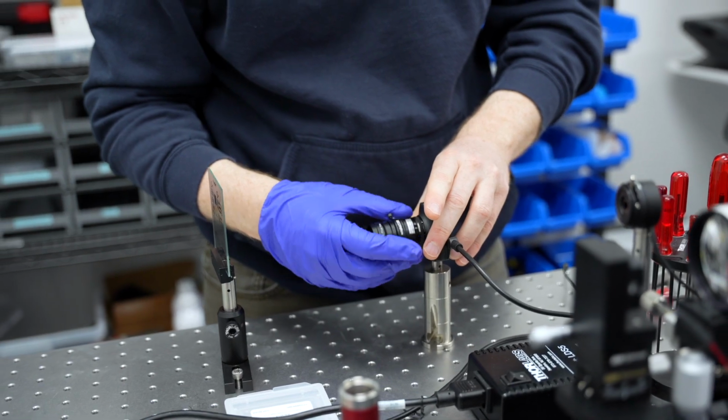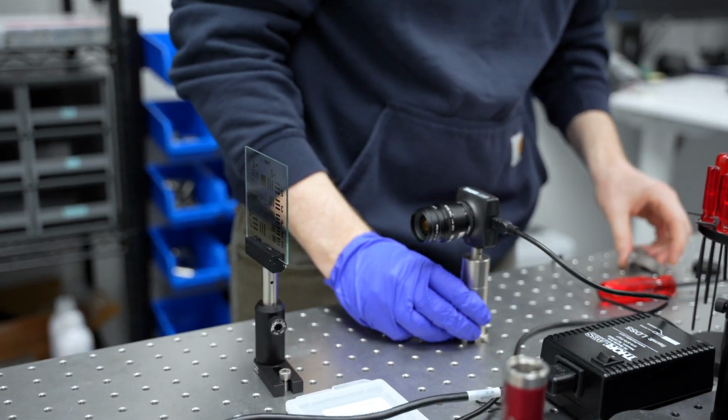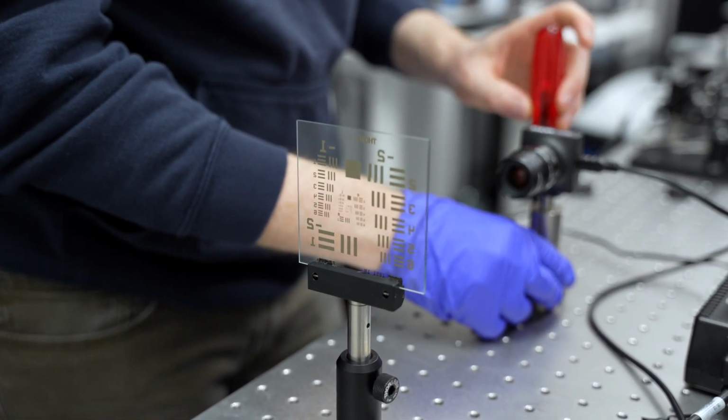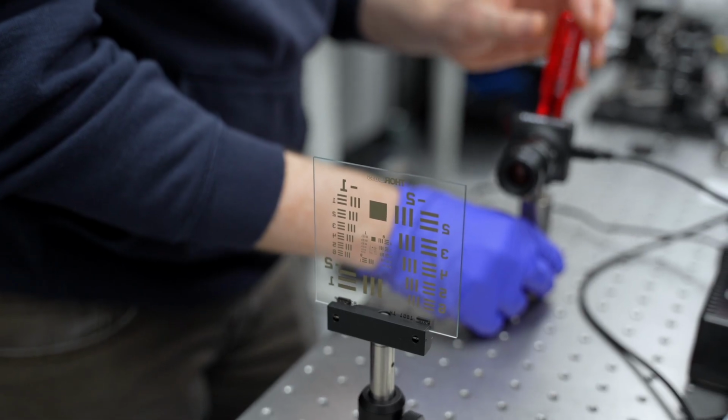surgical or diagnostic instrument. Camera sensors are almost always going to be an off-the-shelf component because most medical device companies don't have the specialized manufacturing required to make them. And these sensors can either come as bare sensors, for which custom electronics need to be implemented, or as integrated camera modules. To choose a sensor, we need to think about what specifications we require.